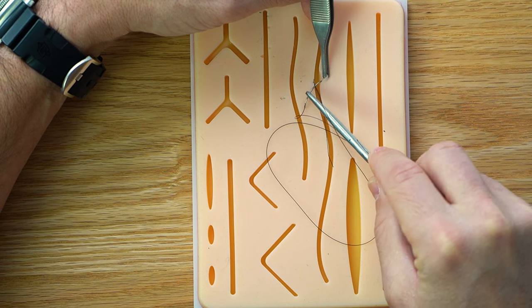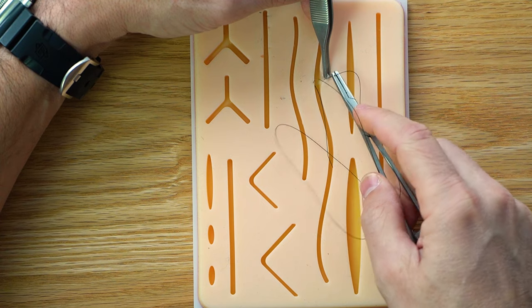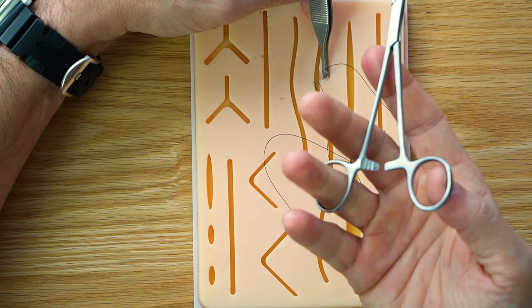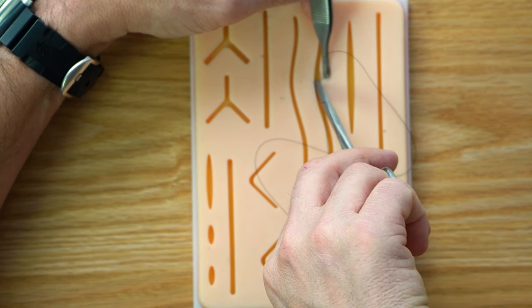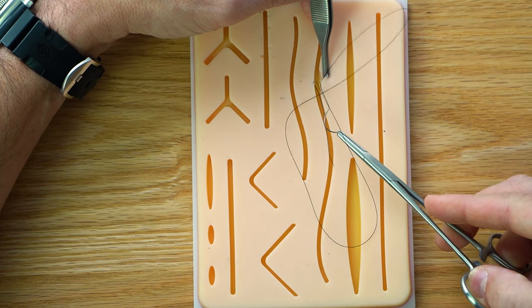So I'm gonna go in here, and then I'm gonna come out deep, and hopefully that depth is the same level I went in the first one, okay? And I do switch back, you see that? I put my fingers in that one. So sometimes when it's a little bit more difficult to get a hold of or whatever, I do put my fingers in the needle driver. If you're palming it, you don't have to palm it all the time. You can switch back and forth.